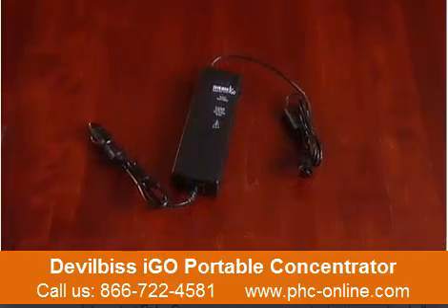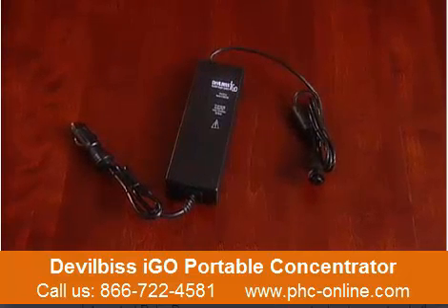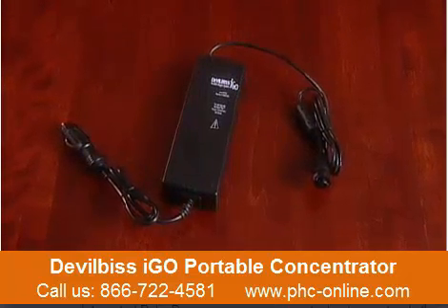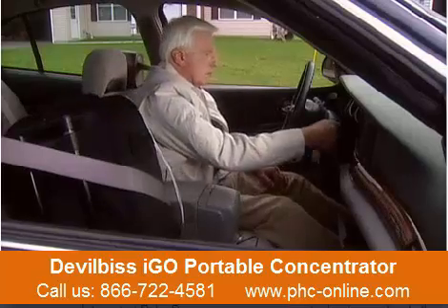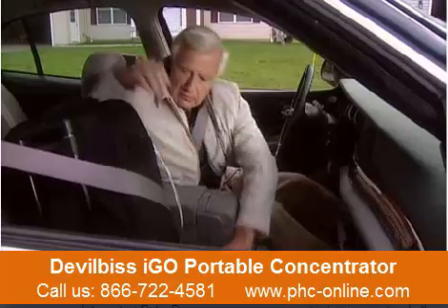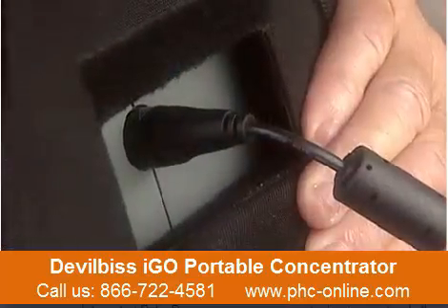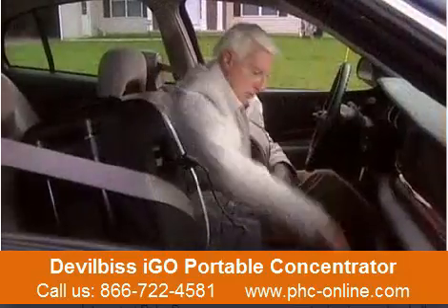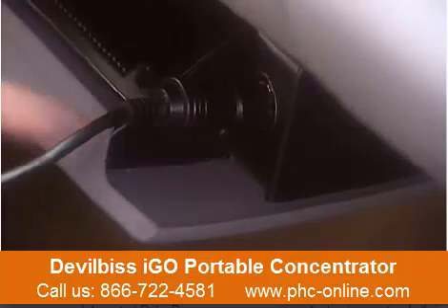Your system also includes a DC adapter to operate the unit from DC accessory outlets, like those found in motor vehicles. Make sure the fuse rating in your vehicle is 15 amps or greater. After you've started your vehicle, insert the DC adapter into the power input on the side of the iGo system. Connect the DC adapter the same way you connected the AC adapter. Insert the other end of the DC adapter into the vehicle's DC accessory outlet.